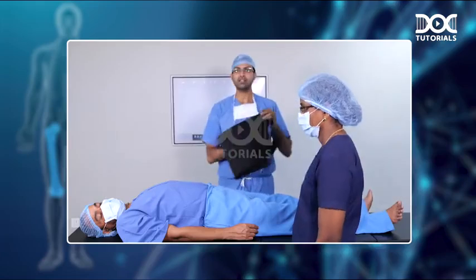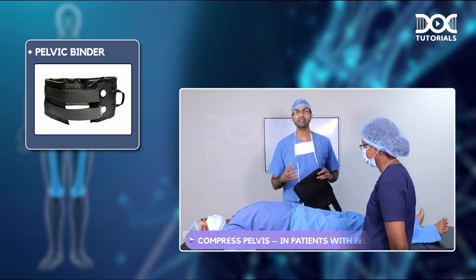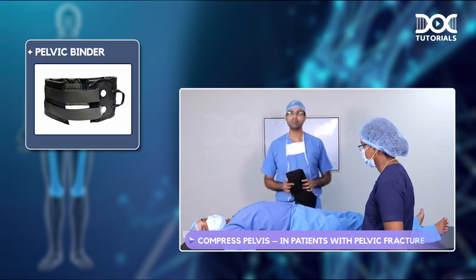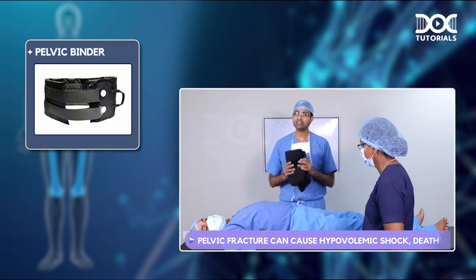Next, let's look at the pelvic binder. What is pelvic binder? It is a device that we use for compressing the pelvis whenever there is a patient with pelvic fractures. Now, what is the problem with pelvic fractures? Pelvic fractures are notorious for causing hypovolemic shock and even death. And why does this happen?